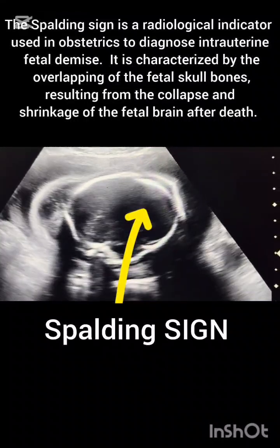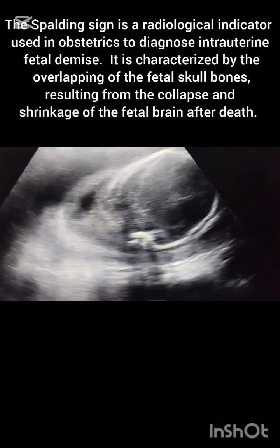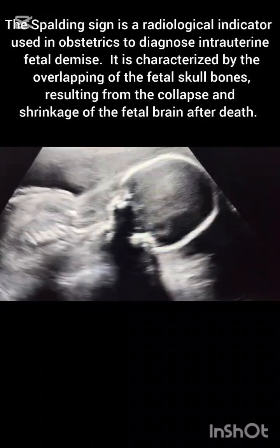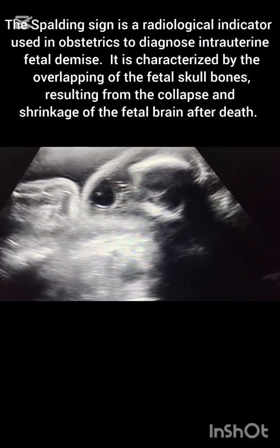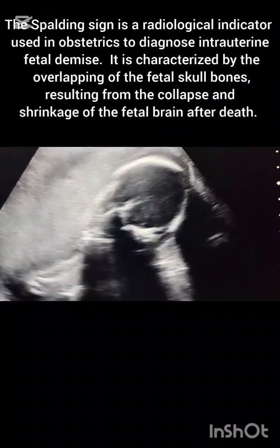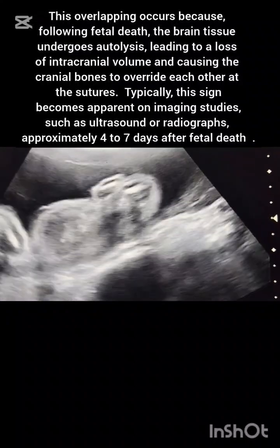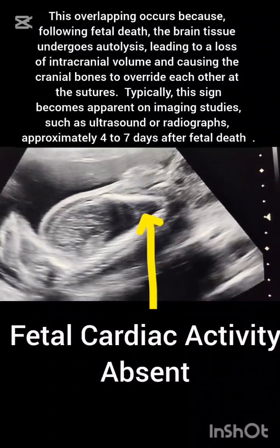Now you can see the overlapping of skull bones resulting from collapse and shrinkage of the fetal brain after death. The fetal brain is floating outside the fetal skull bones, and the membrane is forming outside the fetal skull bones. This overlapping occurred because following fetal death, the brain tissue undergoes autolysis.